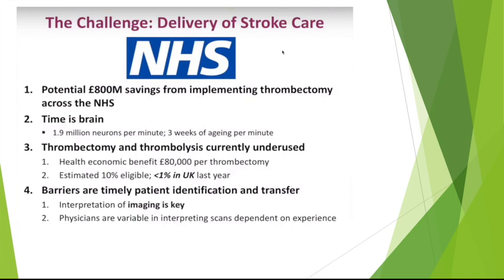By transferring the patients rapidly to the hospital, by making sure that the patient receives a CT scan soon, by making sure that the CT scan is interpreted as quickly as possible, and by taking decisions on the basis of the findings of the CT scan very quickly. As you can see over here, rapid interpretation of the radiological imaging, that is rapid interpretation of CT head, CT angiogram of the aortic arch, carotid and vertebral arteries, as well as intracranial arteries, is extremely crucial.